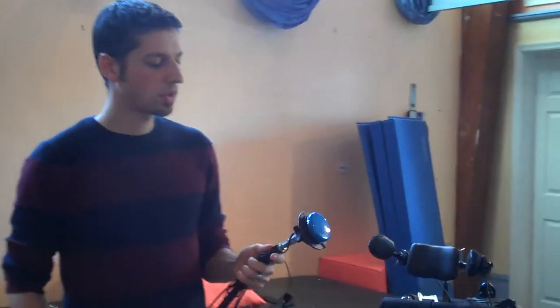Well, I usually start by considering the hand, because the hand is a great manipulator, although we have to not assume that it's a great manipulator for everyone. If they seem to have good dexterity and fine motor skills, then we definitely start with the hand, because the joystick is a very effective way of driving, and of course a very effective way of using an AAC device. But the head array is quite useful and a powerful tool because it's very intuitive for our kids who don't quite have that dexterity. A lot of people want to focus on the hand, but I try not to do that.